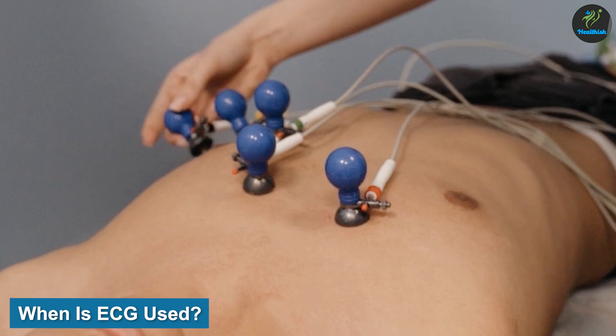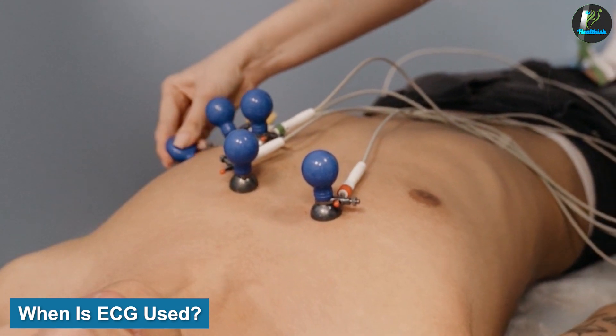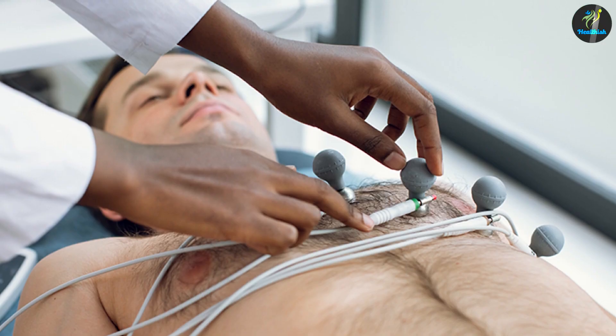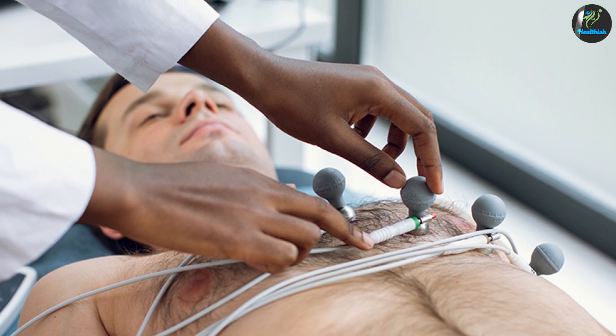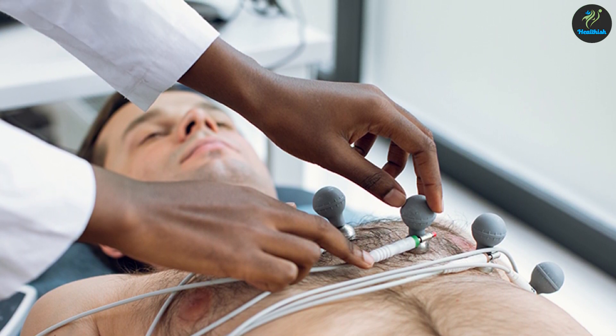ECG is often used to diagnose and monitor various heart conditions, such as arrhythmia, heart attack, and heart failure. It is also used to evaluate the effectiveness of treatments and to monitor patients during and after surgery.